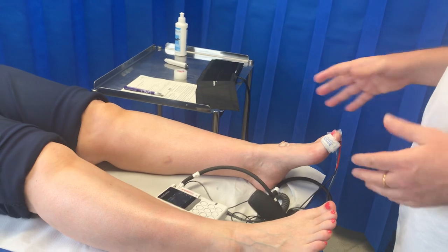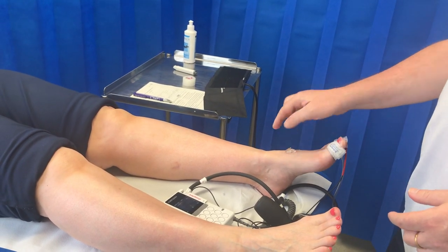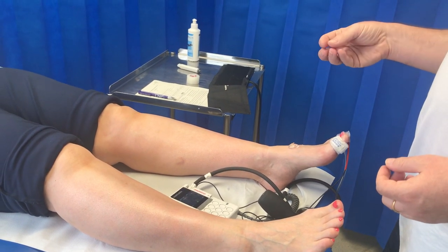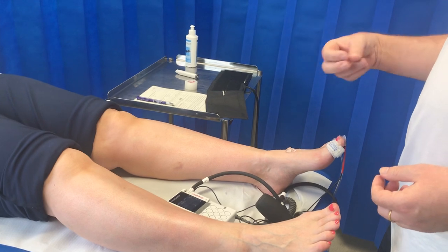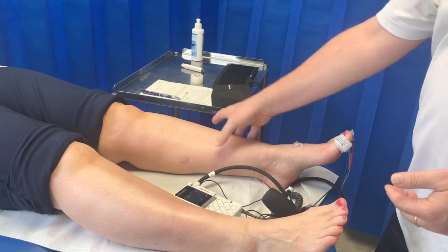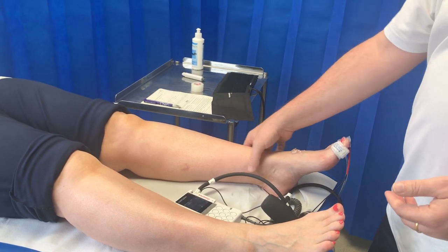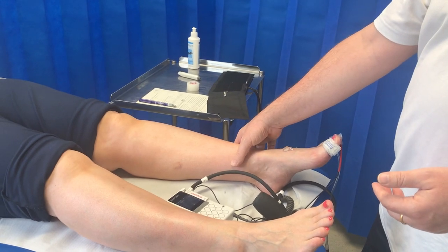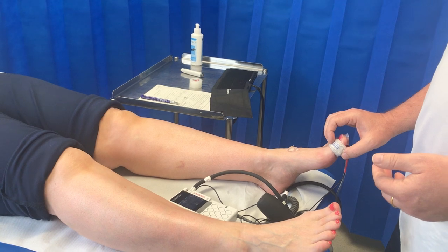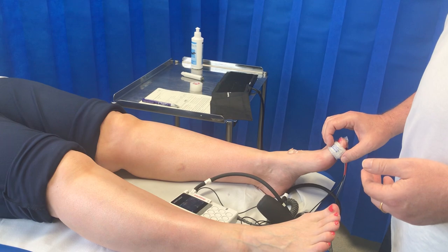The test has now been done. I've got an ankle pressure, a toe pressure, and Doppler readings on the main arteries. That gives me the information I need: whether I have non-palpable pulses, monophasic Doppler signals, and low pressures on the ankle — or if it's calcified, low pressures on the toe. Anything less than 50 mmHg on the ankle indicates critical limb ischemia. Anything less than 30 mmHg on the toe indicates critical limb ischemia.